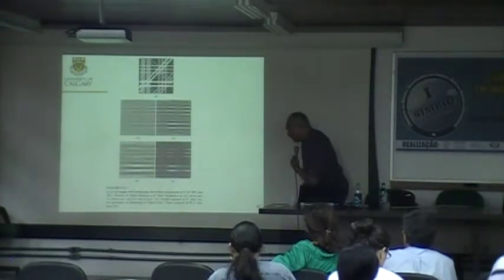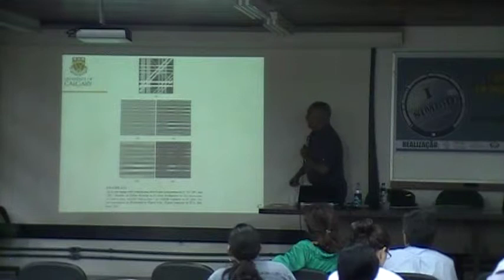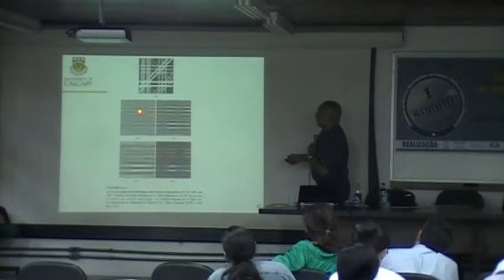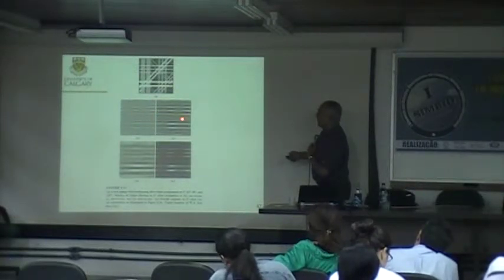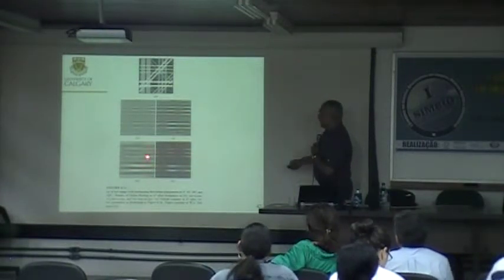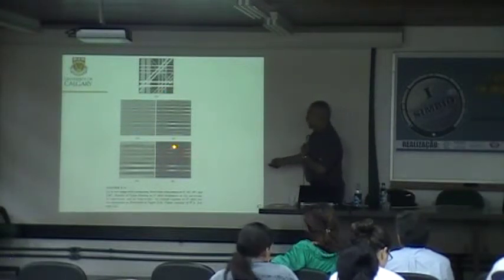So here we have Gabor filters for multiple scales. Different scales will pass different thickness. Small thickness, large thickness, very thick. So you have to combine them all, and when you combine, you get all of these components passed. With different gain, you need to threshold and post-process to detect.